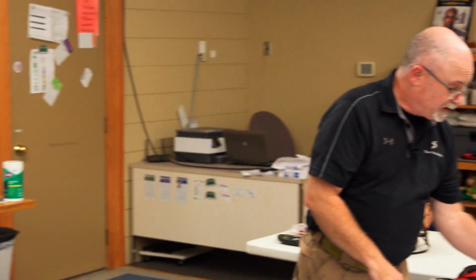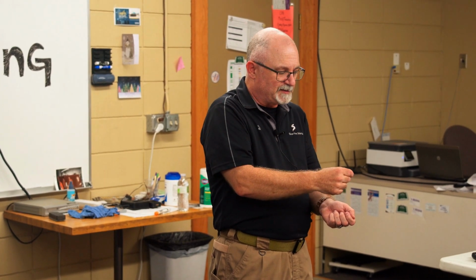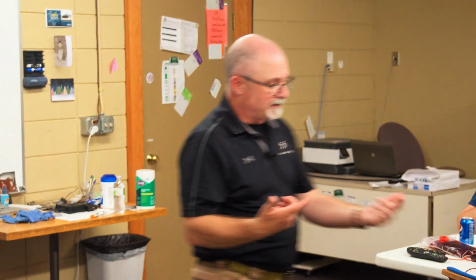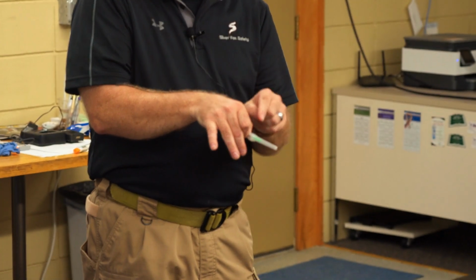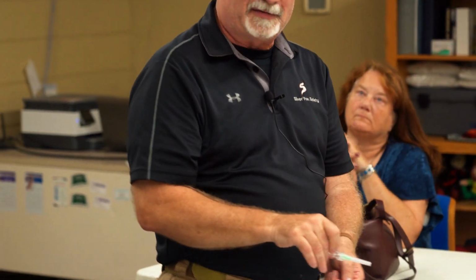The drawback when you get down into, starting even in this 22 range, is because it's so small, your flash, so when you poke through, you have to give it a second or so. Sometimes it takes a little bit for that flash to actually happen, where on an 18, poof, it pretty much goes right in. But you go up to a 16 or a 14, and I'll show you, I'm going to open one of these. One of the other problems there is with a 16 or an 18, the bevel sticks out so far beyond the catheter that you can be in the vein getting flash, but your catheter itself isn't in the vein. If you don't do the follow through, you bounce the catheter up off the top and now you blew it.